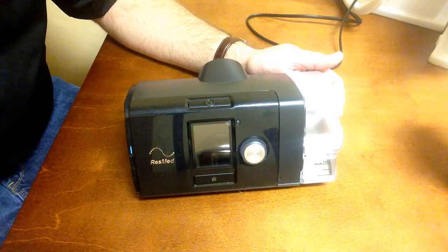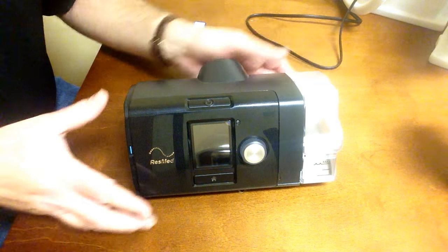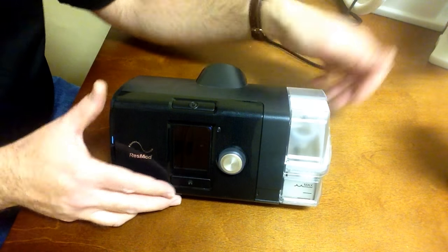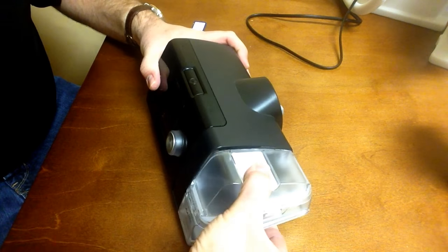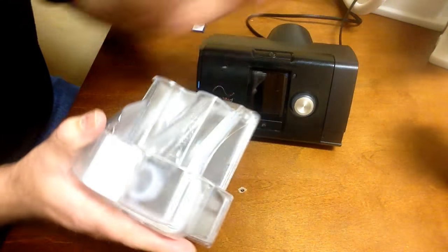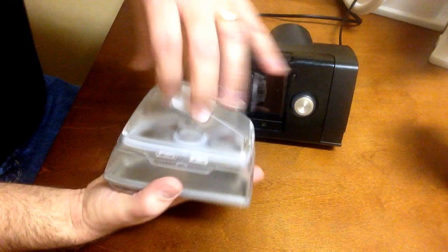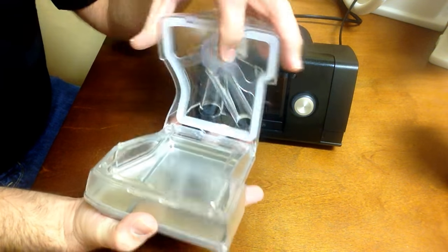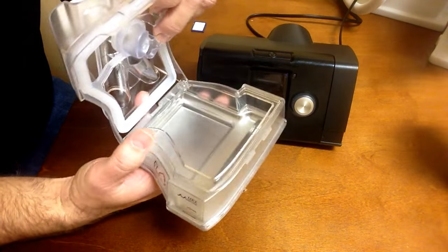With the ResMed AirSense 10 and AirCurve devices, the humidifier is on the right half of the machine, or the right side. That is removed by simply pulling, and with the humidifier chamber on the end, open it up — there are some tabs to be released for opening that, to fill it with water.